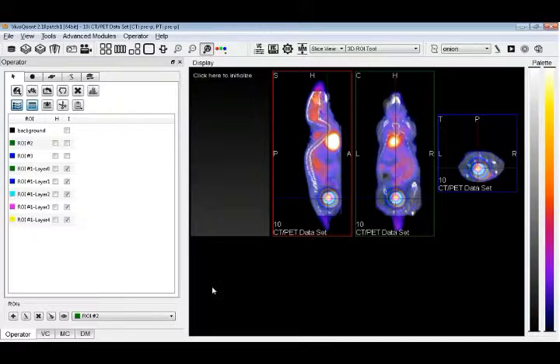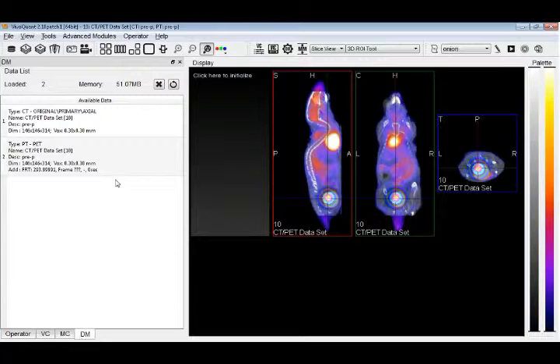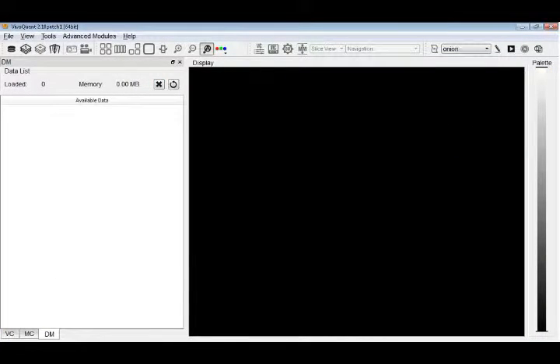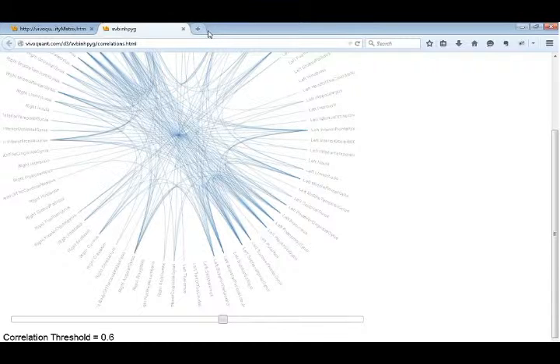I don't have slides. I'm going to attempt to live write a VivoScript from scratch. So wish me luck, and here we go. I think probably the most important thing, let me get rid of all my data so I'm not cheating here, is pointing out where the documentation is. Like if you have a question, what do you do? Because inevitably you will, until you're an expert, obviously. There are a few really nice resources. One is the help guide. Here's some old figures. If you just Google VivoQuant VivoScript help, hope I'm still connected to the internet, or just VivoQuant VivoScript is enough.